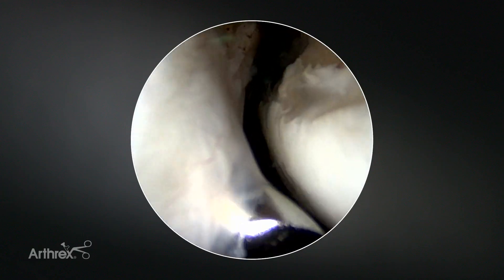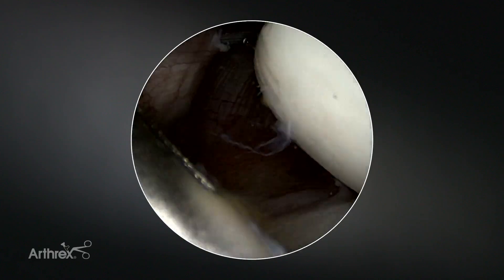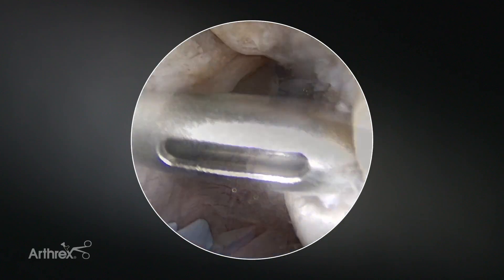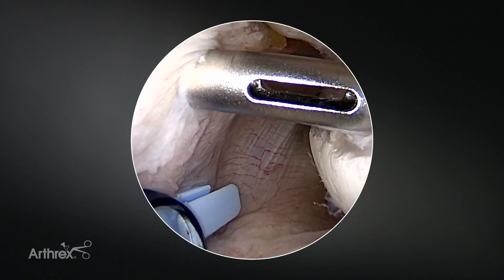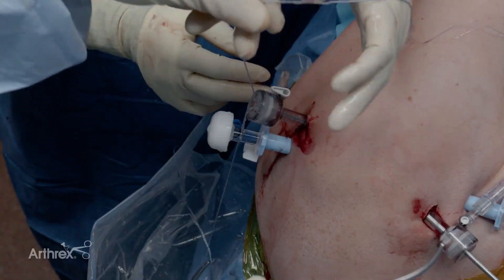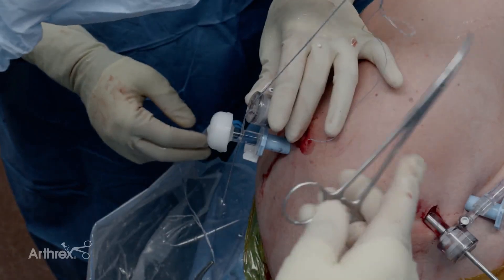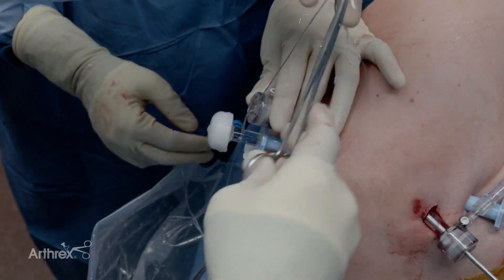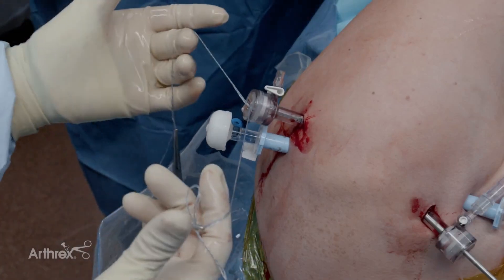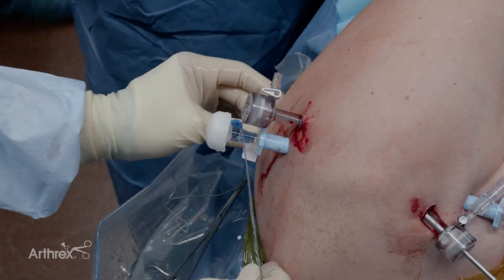Once I go through barely, I'll direct away so as to not damage the cartilage — just use a subtle twisting motion. Again, you can see my anchor placement is in line with the posterior capsule. I'll tag both sets of sutures — I'll typically tag one shorter so that I can distinguish which anchor is which. Both sets of sutures are coming out the posterior cannula and I'll set these to the side.